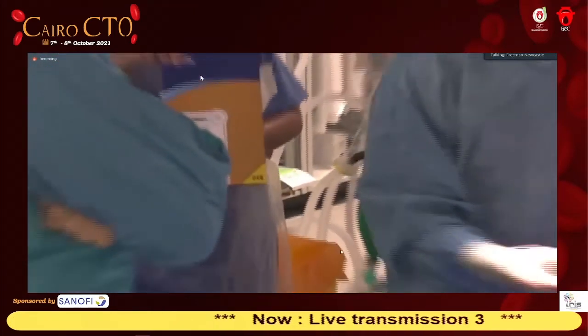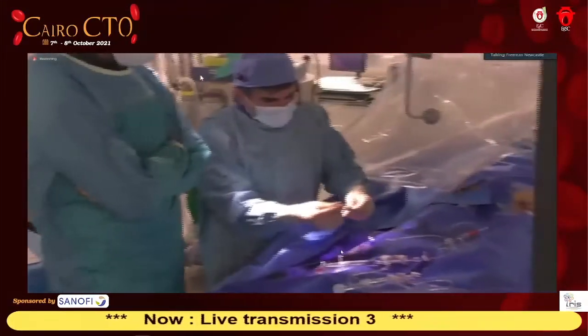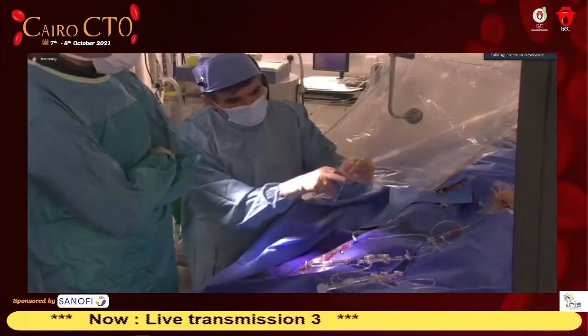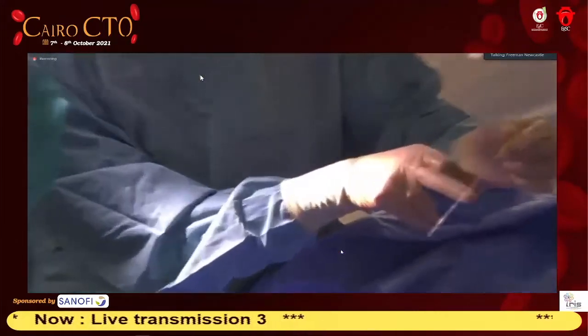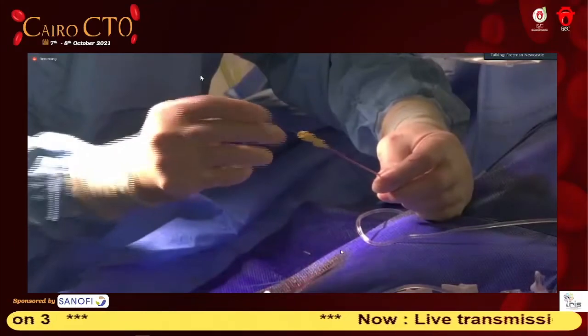Okay. So now this is how it comes. It comes in this little... So I'm taking this out. It comes in this needle, and you could see it there. Yeah. You see the coil? Yes, we saw. So basically, I'm going to introduce it to the microcatheter. There's a pusher here. We'll just push it in. Now it's inside the microcatheter.